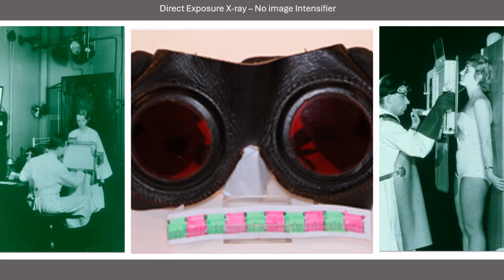In its simplest form, a fluoroscope consists of an X-ray source and a fluorescent screen, between which a patient is placed. However, since the 1950s, most fluoroscopes have included X-ray image intensifiers and cameras as well to improve the image's visibility and make it available on a remote display screen.